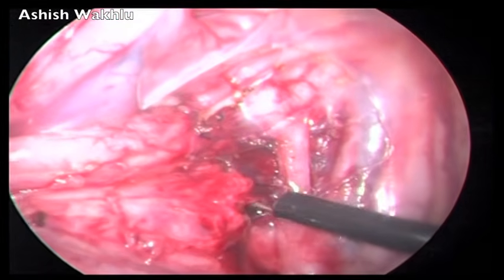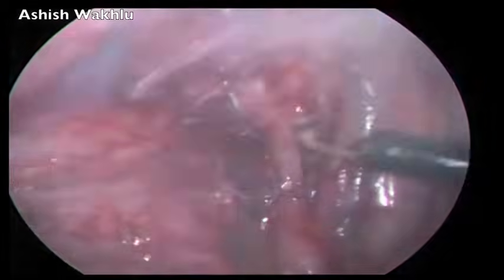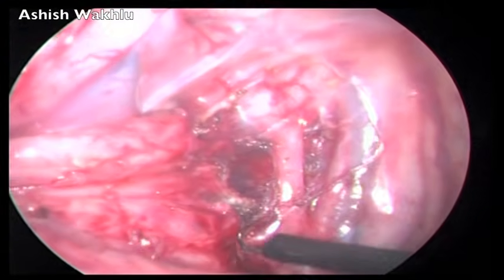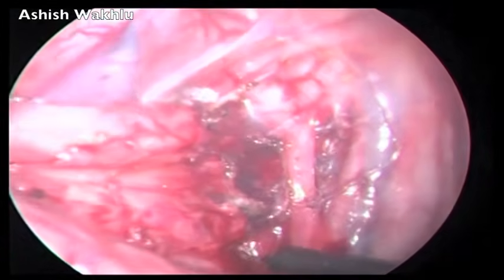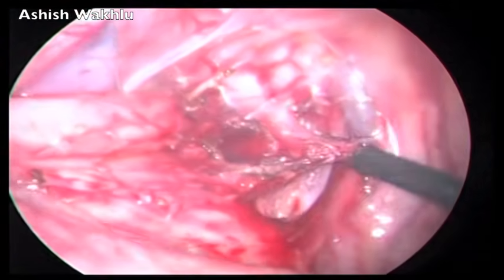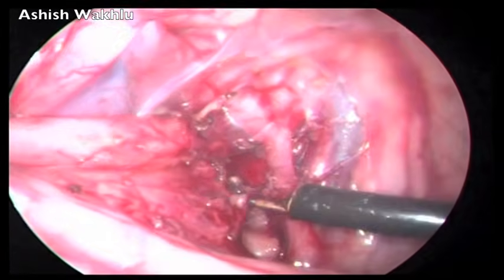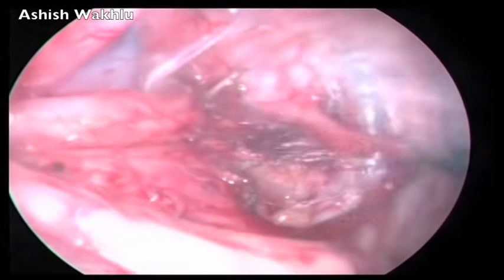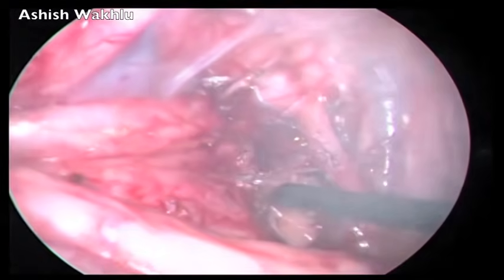As you can see, the ureter is rather close to the wall of the bowel at this spot, and therefore, as the dissection proceeds, it gets somewhat skeletonized. It is good to stay as far away from the ureter as possible because the heat generated from the cautery hook has the potential to damage the ureter. Therefore, if at all conveniently possible, the ureter should be moved away from the line of dissection as quickly as possible.